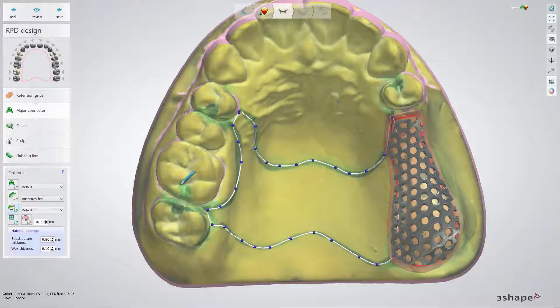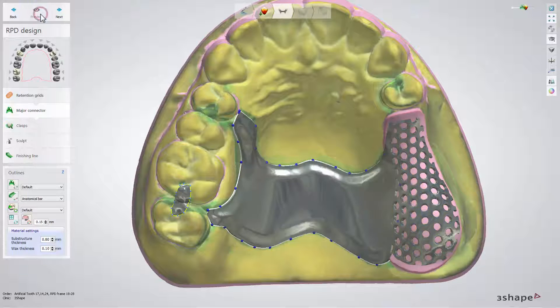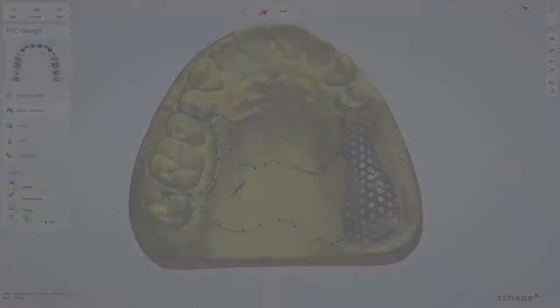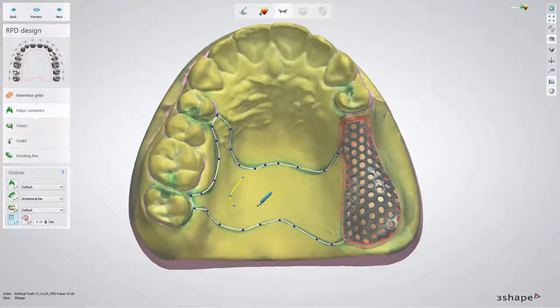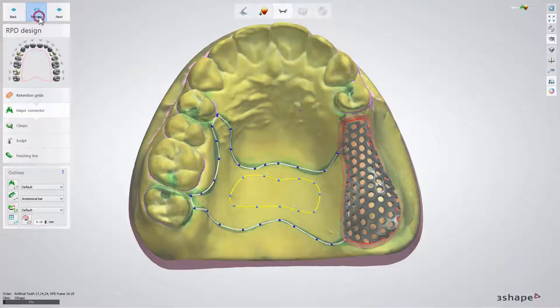You can add occlusal rests for teeth. Windows are the special openings in the Major Connector or Relief Zone on the inner part of a denture. To finalize the outlines, the last spline point needs to be clicked once. Click Preview to see the results.